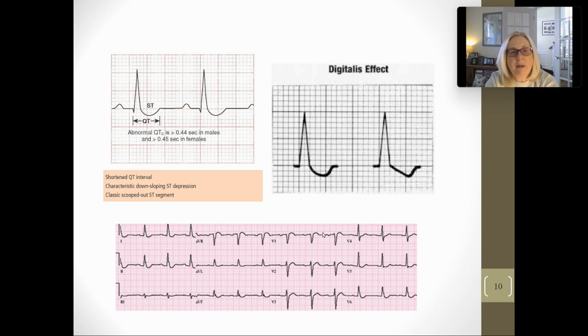If you want to, on your paper, I believe you have these pictures. If you want to circle the scooping effect on there, you certainly can. I have the smaller ones, I see. I have your paper here with me.